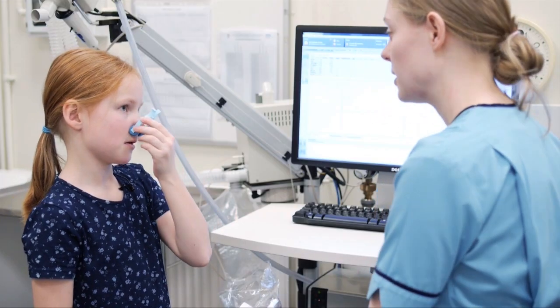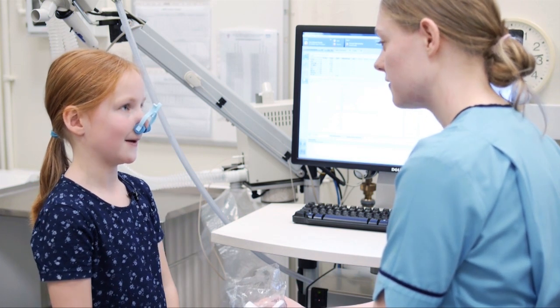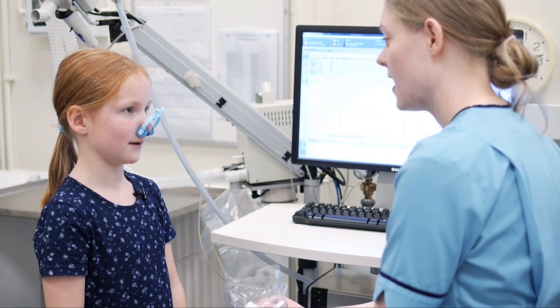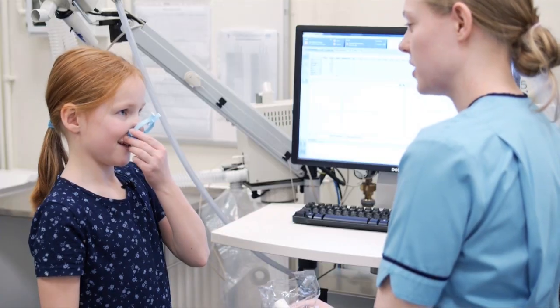So the first test — what I'll get you to do is nice normal breathing like you're doing just now but into my machine. Then I'll get you to do a really big breath in, fill up your lungs all the way to the top, and then blow it out really fast for as long as you can, and then a nice big breath in again at the end. So I'm going to show you what I want you to do. All the way in again.